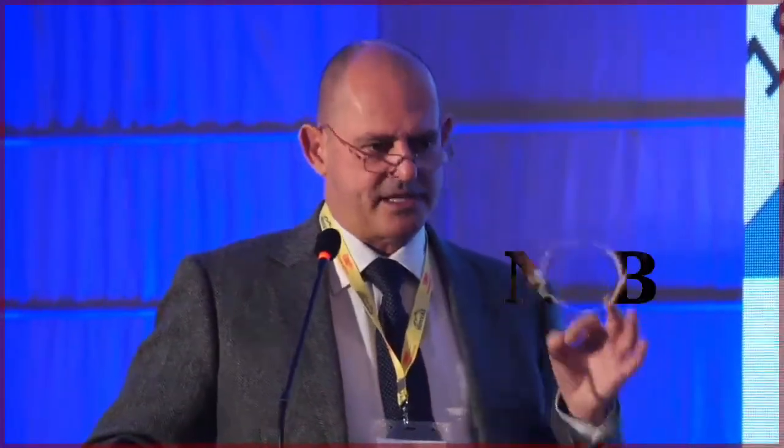So this is the first. The second thing is that EEG is not a system that covers 100% of the ischemia. It's only cortical. You don't see problems of the deep tissue or of the trunk of the brain.